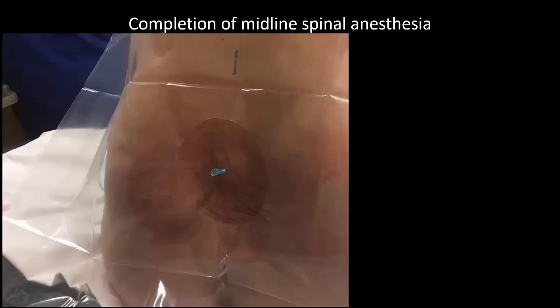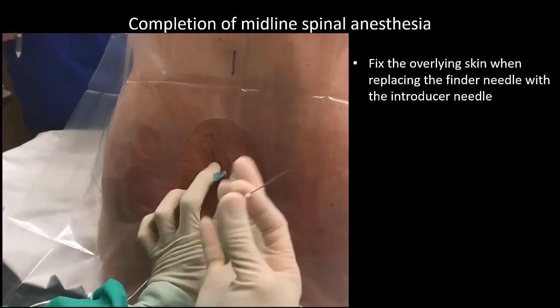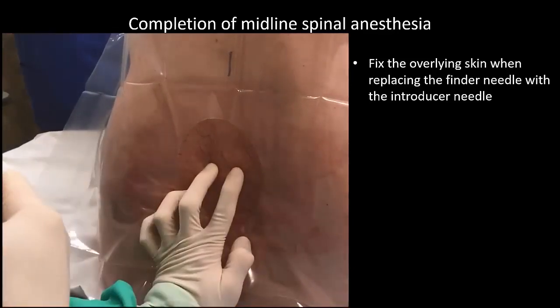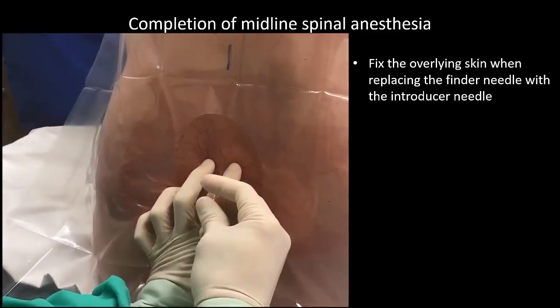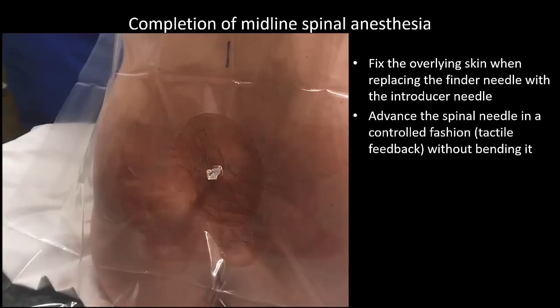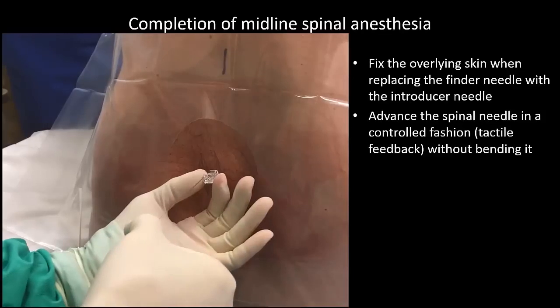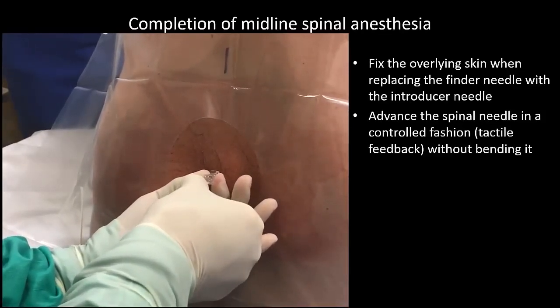This video illustrates the steps discussed above. We fix the overlying skin with our 2 fingers, and only then do we withdraw the finder needle and replace it with the introducer. I try as far as possible not to take my eyes off the patient so that I can exactly replicate the trajectory with the introducer. I like to push the introducer in with my thumb as it gives me the best feel. The left hand holding the introducer is responsible for controlling direction and trajectory. The right hand merely advances the needle forwards in a controlled fashion, sensing the feel of tissues at the tip and ensuring it does not bend.